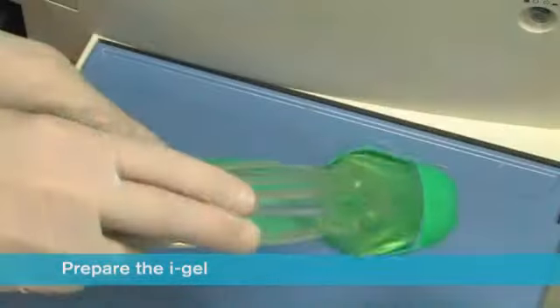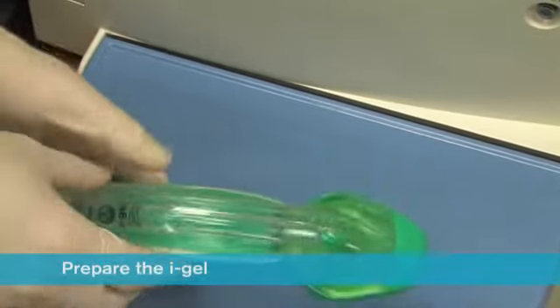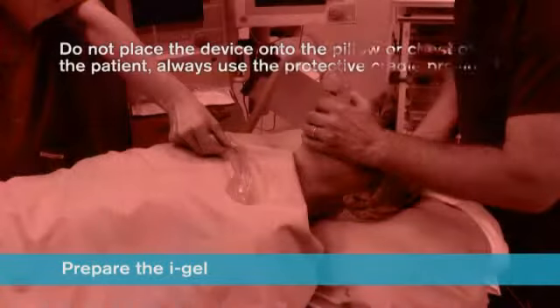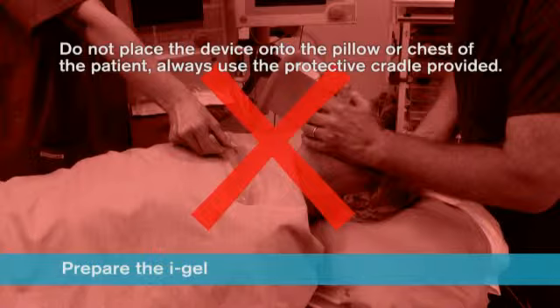Place the iGel back into the cradle in preparation for insertion. Do not place the device onto the pillow or chest of the patient and always use the protective cradle provided.